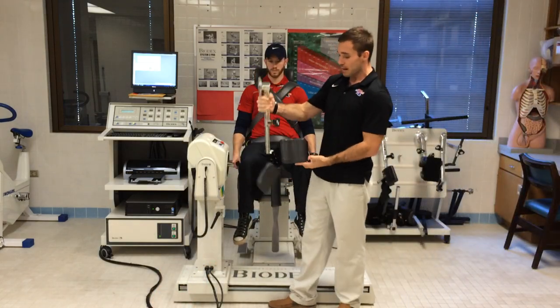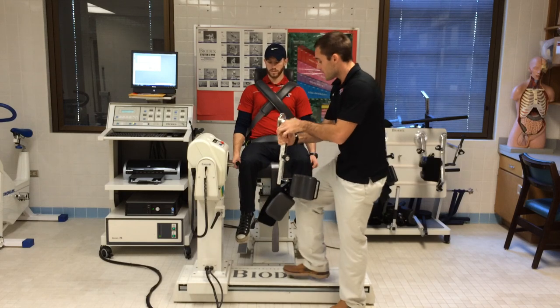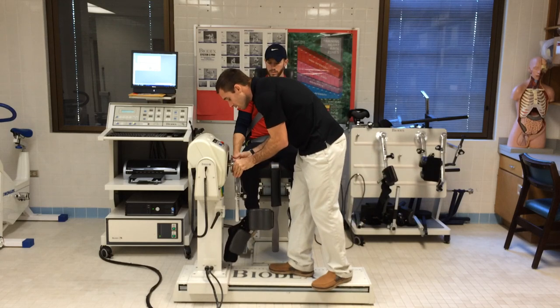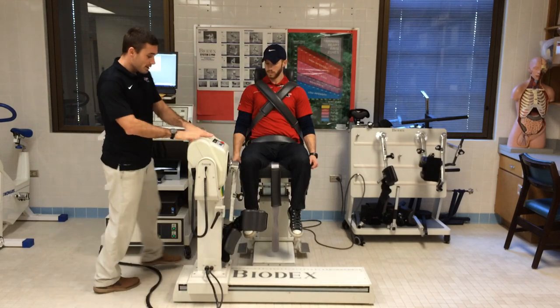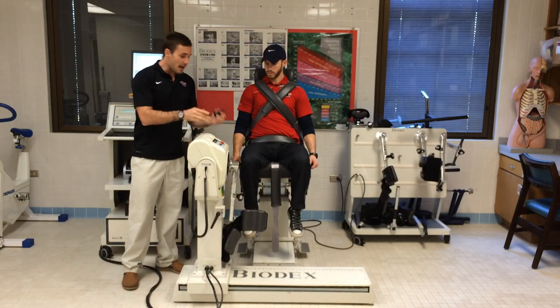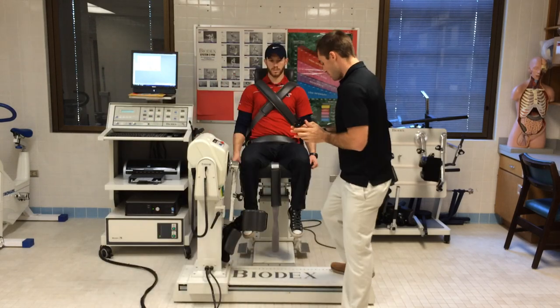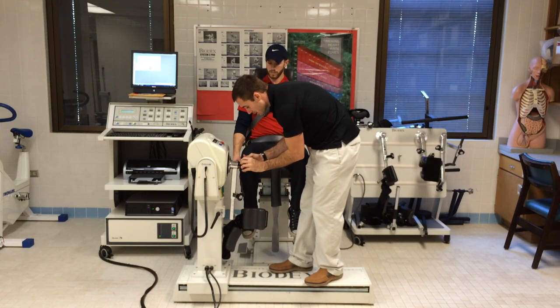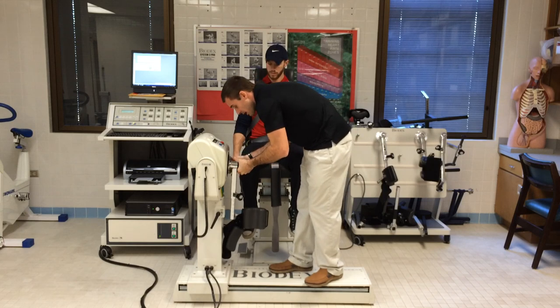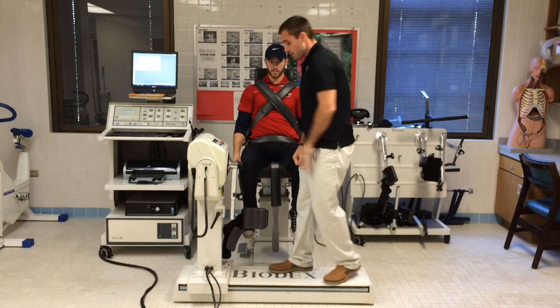And you can see if it's strapped in, his ankle will come right on this pad. Another good sign. We're going to make sure we align this here, and make sure we get that locked on there good. On the side of this, there's going to be a black kind of almost screw looking thing. This is what's going to lock that leg piece into the dynamometer. So we make sure that this is aligned up. We're going to screw this in pretty tight, because the last thing we want is this to come off during the test. We look good to go.